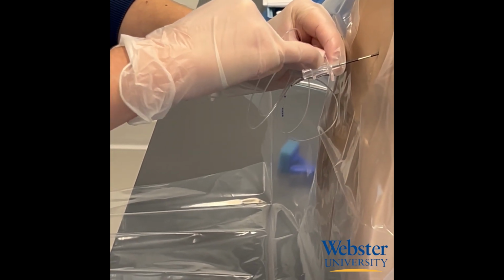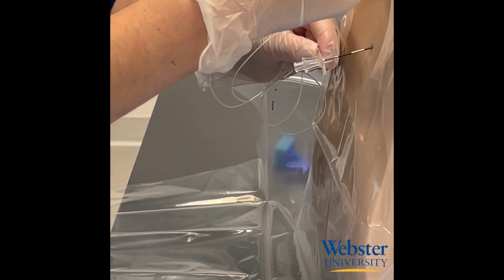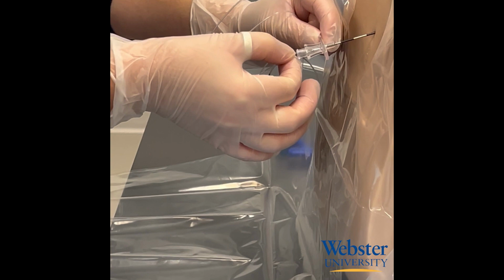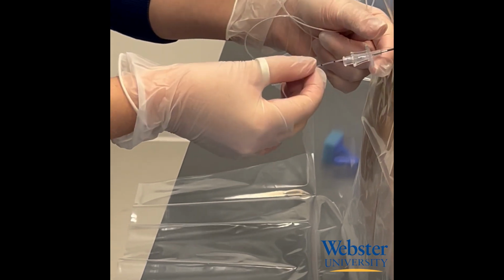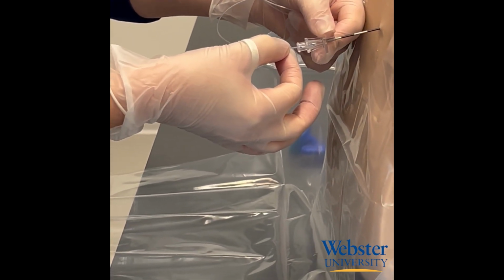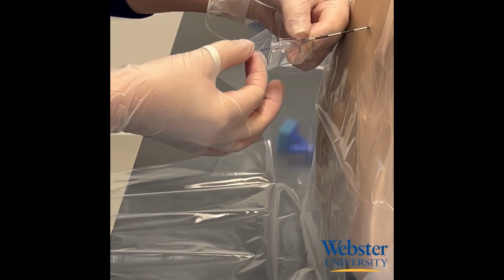Now you can see the 3 hash marks in the window here. So you know you're at 15 centimeters. So there's 5 centimeters sticking out the end of the epidural needle. Once you reach this point, you can insert an extra centimeter and then you're going to remove the epidural needle as you push the catheter in to prevent a portion of the catheter coming out with the needle.